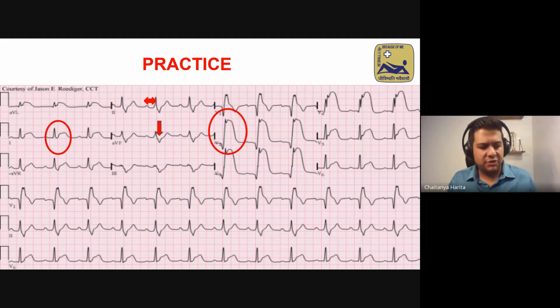Does anyone want to tell me all the findings in this? Anybody else can put up their hand and volunteer, please. Anyone? Don't make me call names out like I used to in your Zoom classes during COVID, when nobody bothered answering. But does anybody want to volunteer?